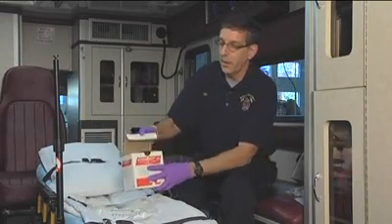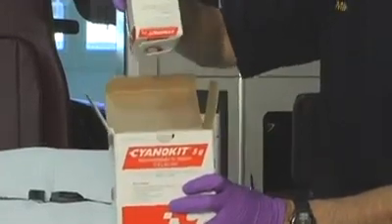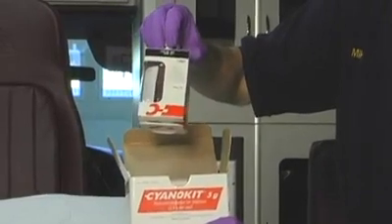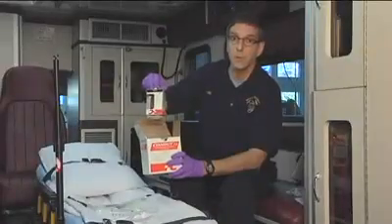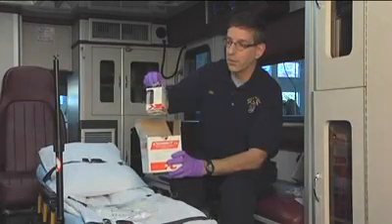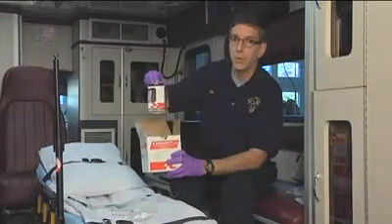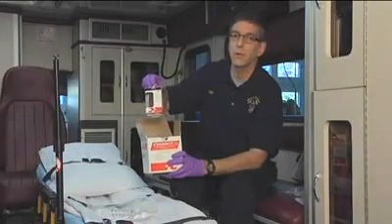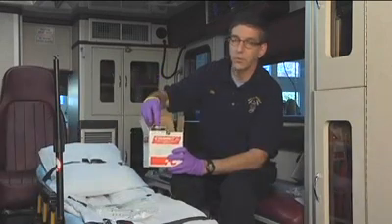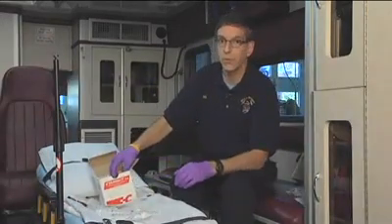Inside the Cyanokit are currently two glass bottles that contain the Cyanokit powder, which needs to be mixed with the diluent — the 100 cc bags of normal saline. Each bottle mixes with 100 cc's of diluent and then gets administered to the patient over the course of seven and a half minutes. So you give two bottles, a total of five grams of Cyanokit, to an adult patient over the course of 15 minutes.